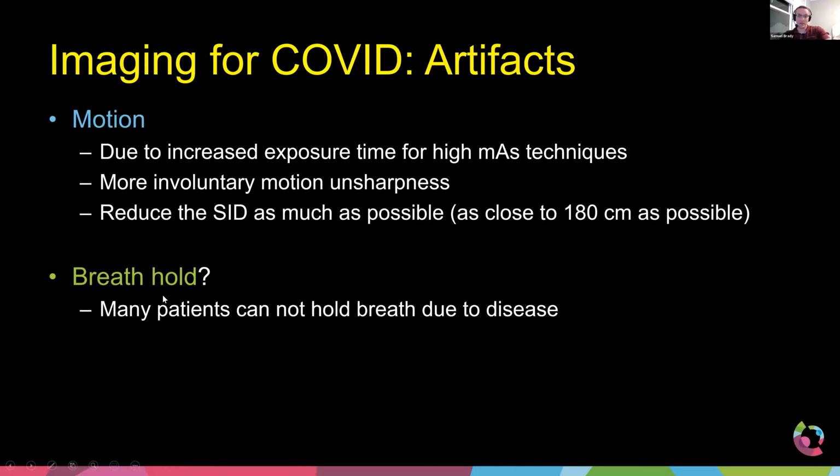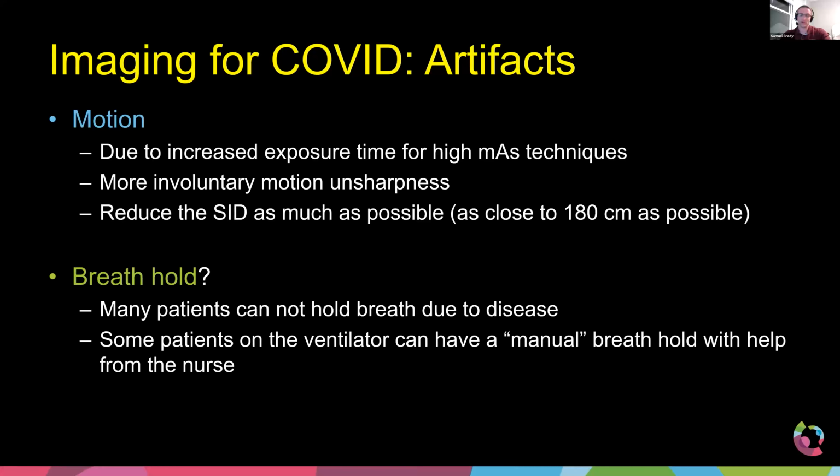Breath holds, can you do it? Probably not. If the patient can hold their breath, we know the exposure is very short, less than a second to acquire the image. But for some patients, that might be an eternity, and so you may not get a good breath hold. But you do still want as much of a breath hold as possible, because that expands the lung cavity. It puts air into the parenchyma, the lung tissue, so you can get a good image of the lung parenchyma instead of it being collapsed on itself, which makes it more dense, more white instead of black.